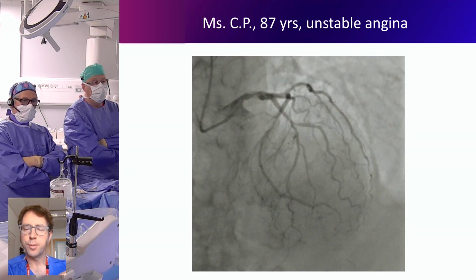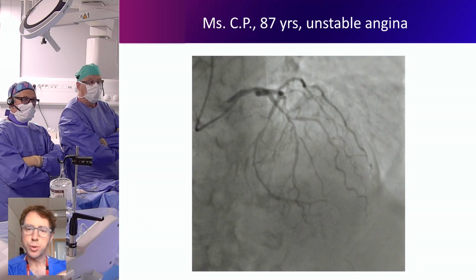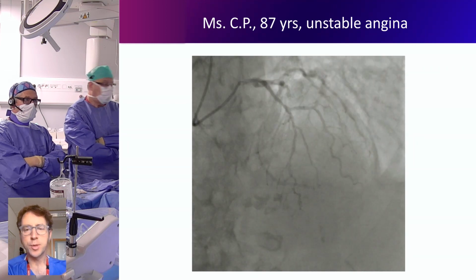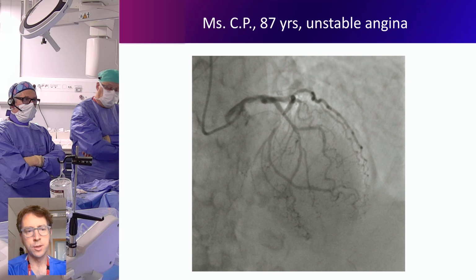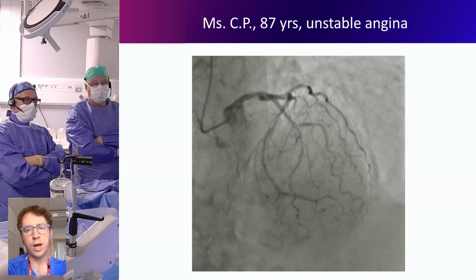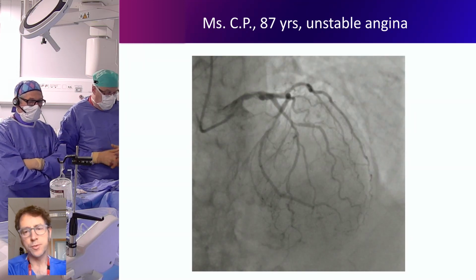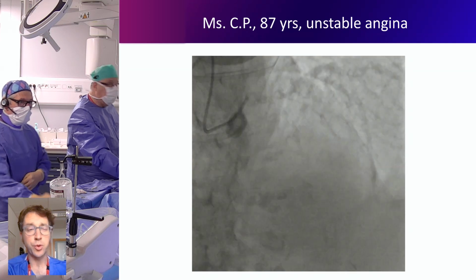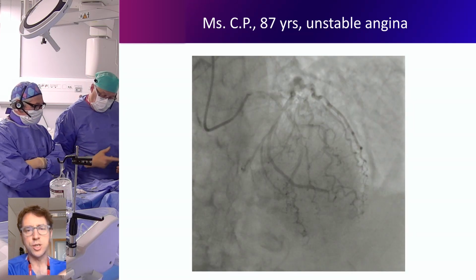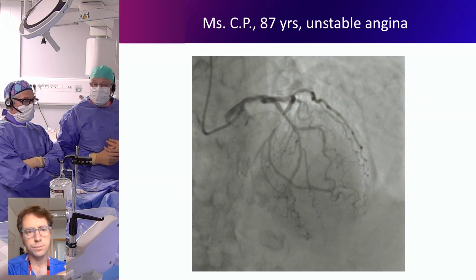But from a technical perspective, the one element I think is most important, that you've already highlighted, is this discrepancy in caliber from the proximal to the distal vessel, which also has to be taken into consideration here. So I would go with a provisional approach. The disease in the ostium of the diagonal clearly needs protection with a wire in my practice, but I'd hand over to you in terms of what you're intending technically.